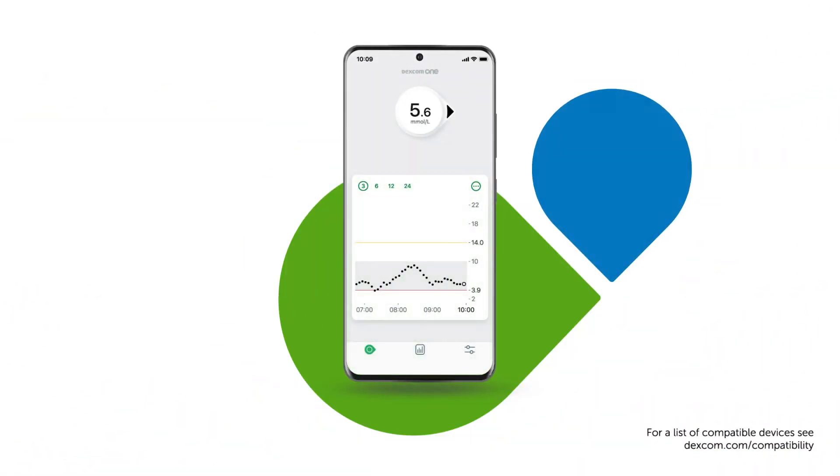Your smartphone shows where your glucose is at and which direction it is heading. You can also set up optional glucose alerts.